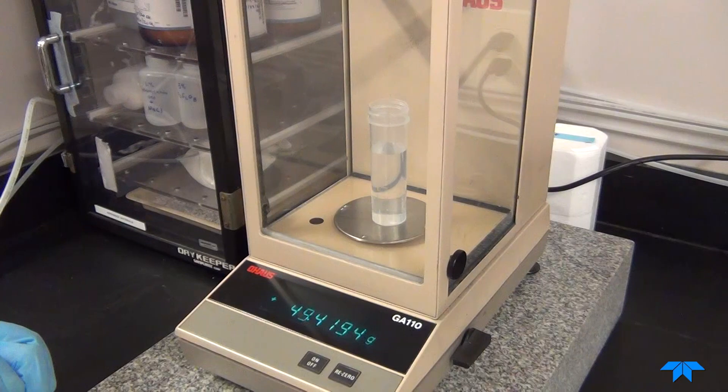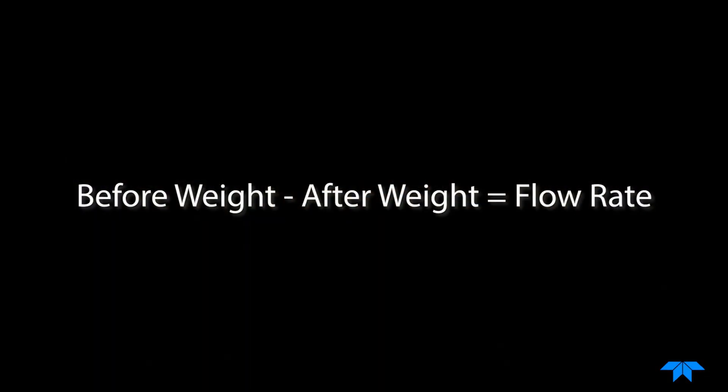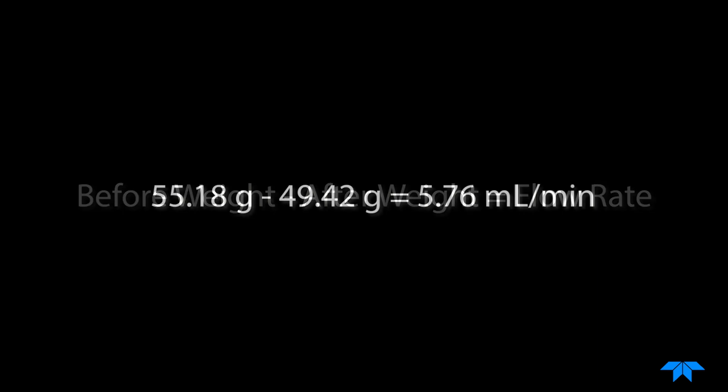To determine the uptake volume, subtract the after weight from the before weight. In our case, it was 55.8 grams minus 49.42 grams. The stannous chloride reagent flow rate is 5.76 milliliters per minute, right on target.